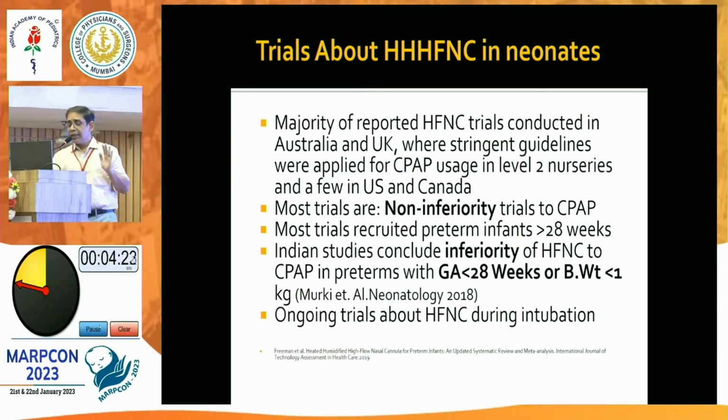But one interesting trial that is ongoing is giving high flow nasal cannula during intubation, because during intubation we stop bagging or we stop oxygen because we have to intubate the baby. But if the high flow cannula stays in the nose while we intubate orally, there will be fewer chances of hypoxia and adverse events.